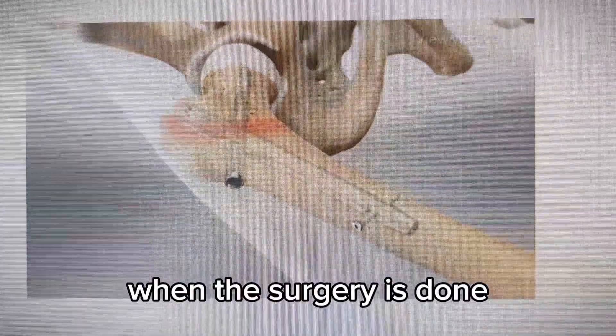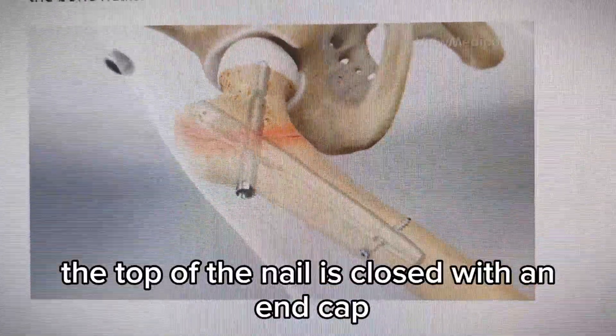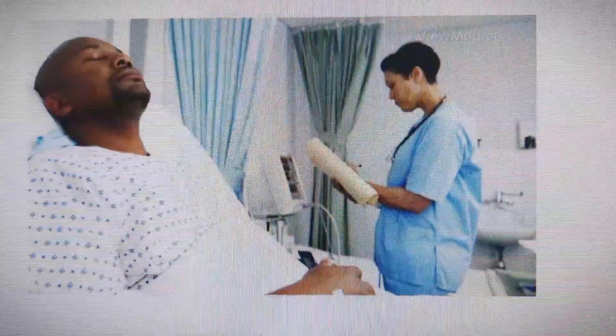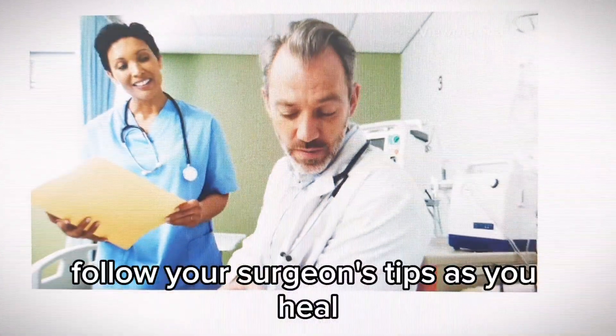When the surgery is done, the top of the nail is closed with an end cap, and the incisions are closed. You're watched in a recovery room for a brief time. Follow your surgeon's tips as you heal.